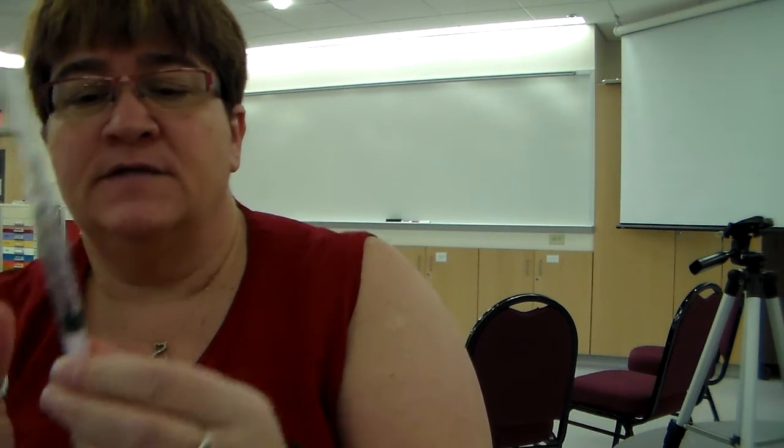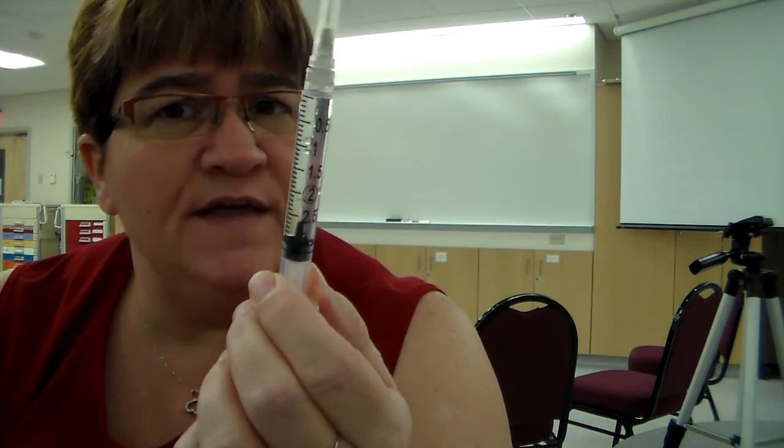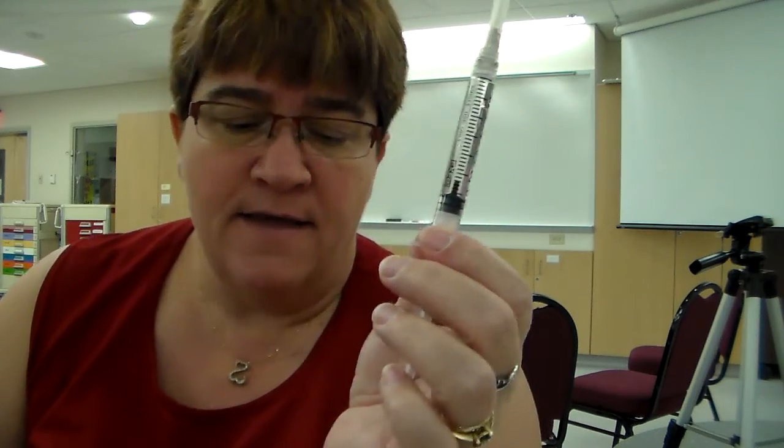How do you recap again? That's right. The needle cap stays on the counter, and you scoop the cover up onto your needle, okay? So now we have 3 milliliters of medicine in the syringe. Okay, so now remember, we're still in the medicine room, not in the patient's room. So we have to go from the medicine room to our patient's room, and that may be a little walk. Okay, so you have to take and label this medicine.